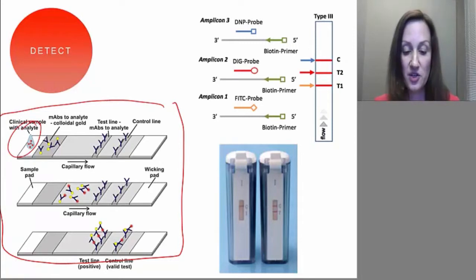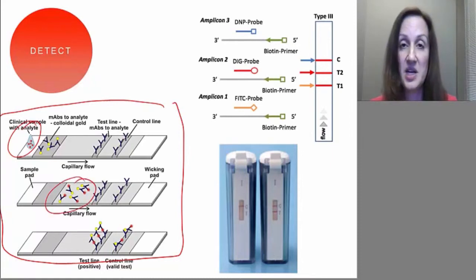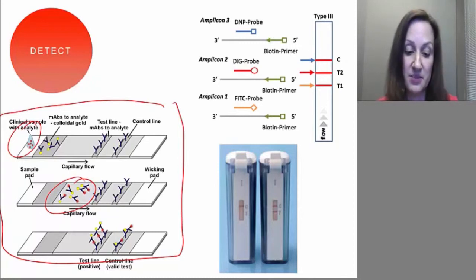As the sample flows along the lateral flow strip, which is just a piece of absorbent paper, the sample first comes into contact with an antibody that's attached to a colloidal gold particle. If the analyte is present in the sample, it'll bind to that antibody. Now you have an antibody that's bound first to your analyte and also to a gold nanoparticle, which when clustered on a paper strip becomes visible as the little red line that your eye sees when you're running a pregnancy test.